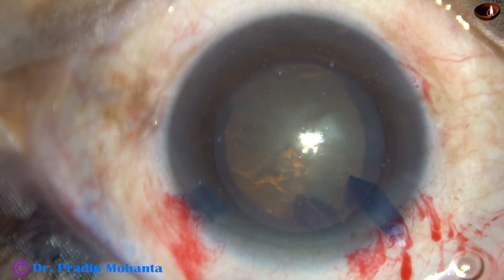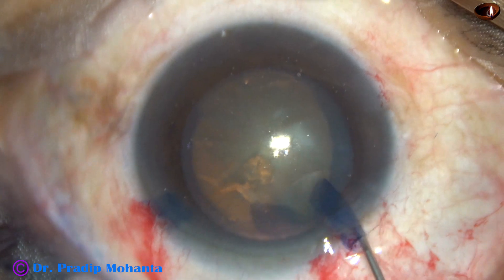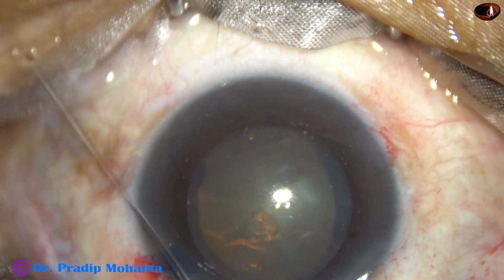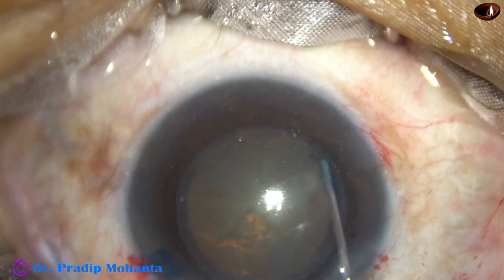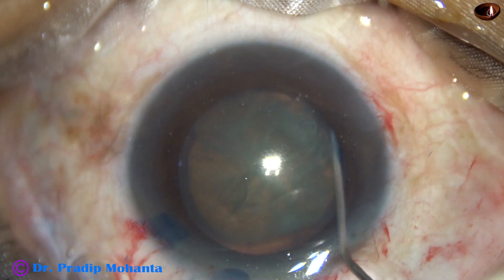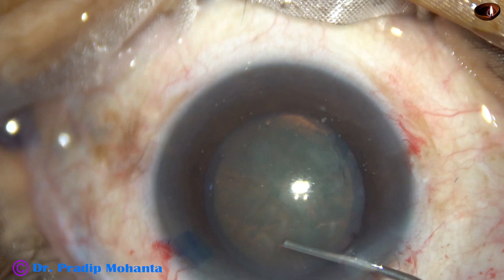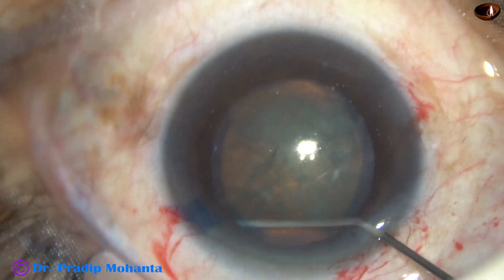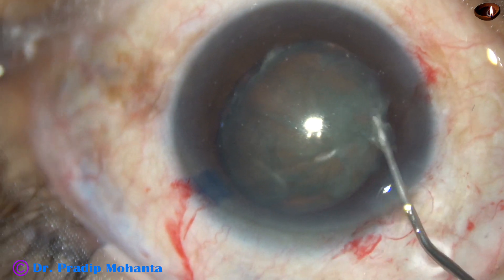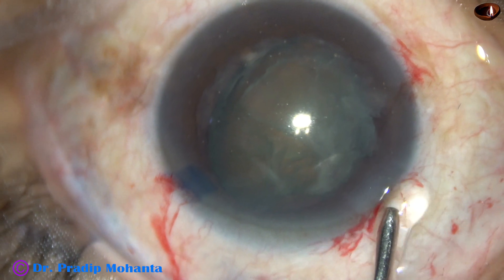And now, hydrodissection. For lens tilt technique, you must tilt the nucleus and the equator should come out of the capsular bag. Here it is — do hydrodissection. Some more fluid has to be injected. The nucleus is quite large, about 6 mm. And as the fluid goes behind the nucleus, the lens tilts.